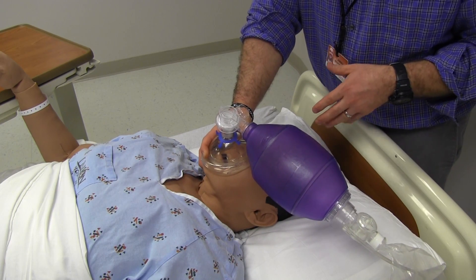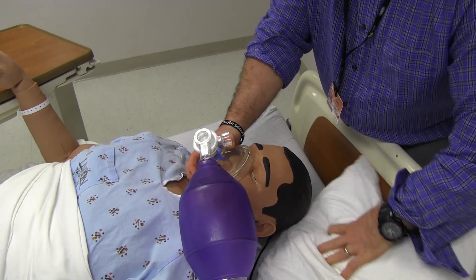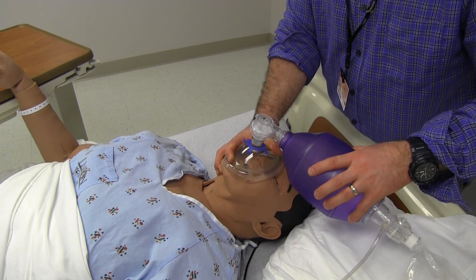This technique isn't great if the patient has a pillow, because that's not fully straightening out their airway. I would remove the pillow so their head comes down to the patient cot, and then that's how I'm going to deliver the breath.